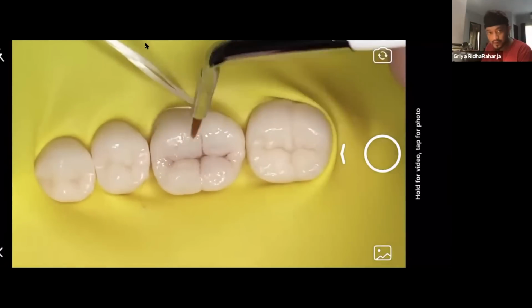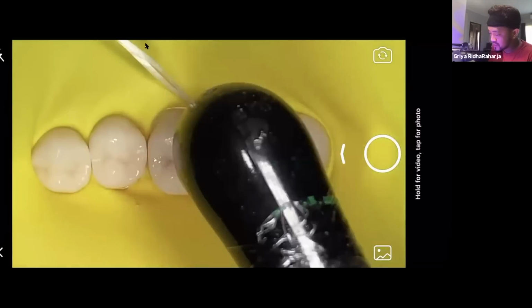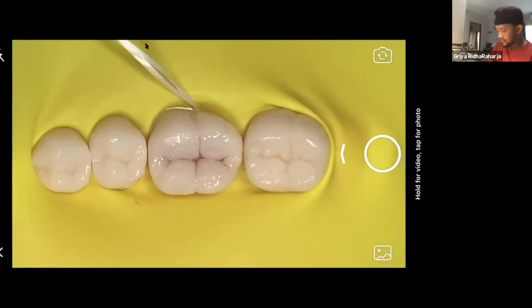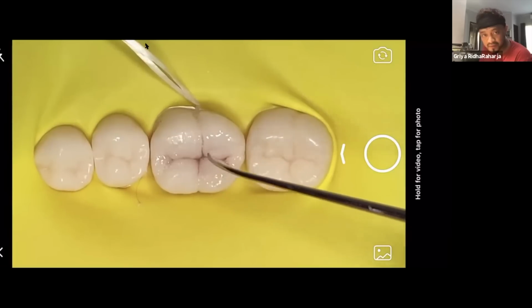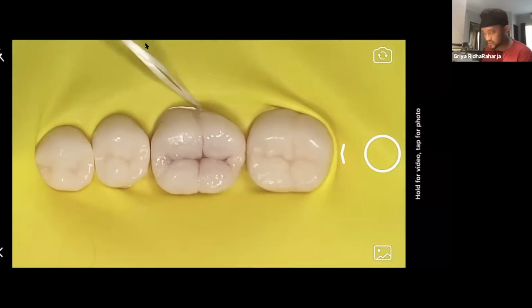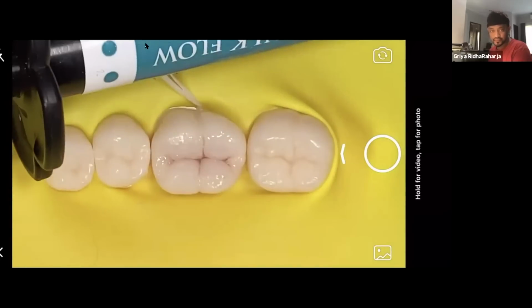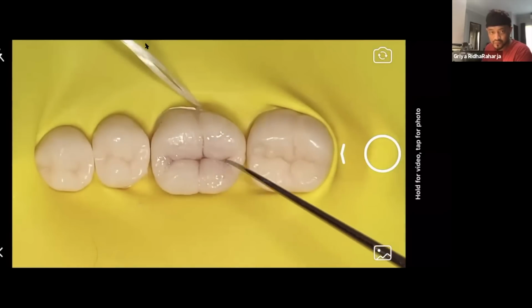Okay, now I will like here. So if you have gaps between the fissure, if you have big gaps, it's okay. Don't be sad, because mostly I will cover these gaps. You see, I have gaps in here also. So this is nice. You can use the bulk fill flowable to cover all the gaps between the groove.